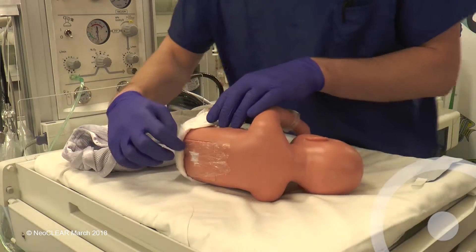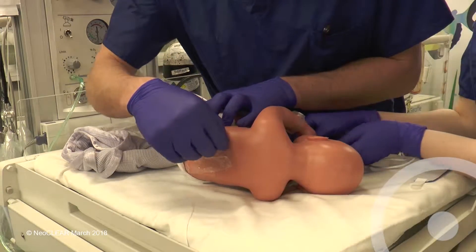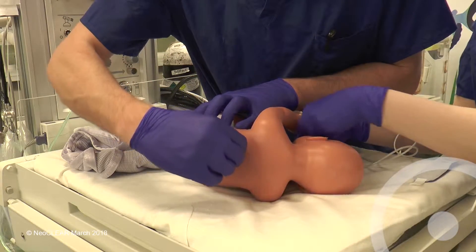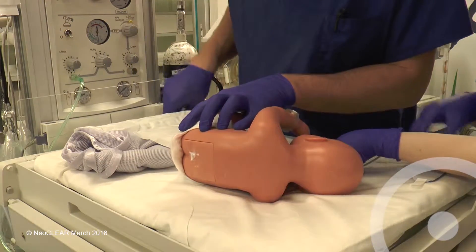Term babies should have had local anaesthetic cream applied. Remove this and clean any soiled skin with water. Attach the SATS monitor to the right hand and ensure that the trace is adequate.